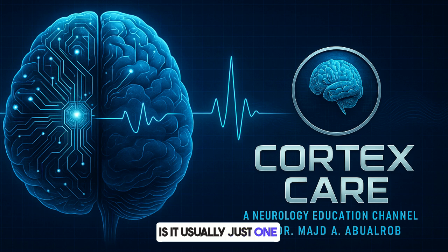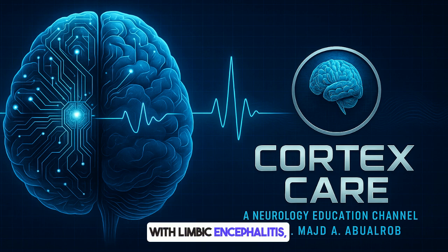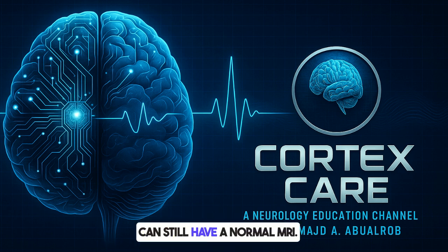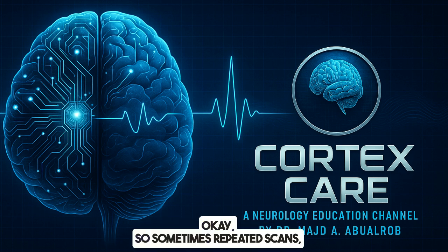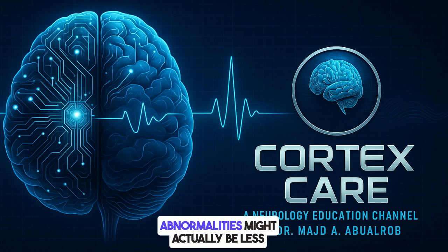Is it usually just one side, like in the figure? It can be unilateral or bilateral. But it's important to remember, even with limbic encephalitis, a significant chunk, maybe 30–40%, can still have a normal MRI. Still. Okay. So sometimes repeated scans, maybe higher resolution, are needed. And interestingly, during relapses, MRI abnormalities might actually be less common than in the first episode.